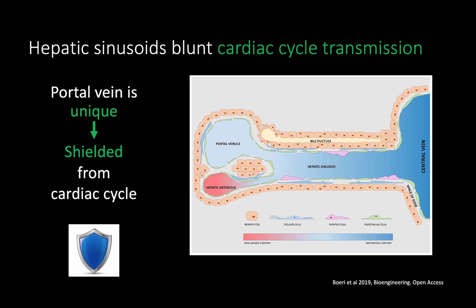The portal vein is unique in its isolation from the arterial and venous system, respectively by their splanchnic capillaries and the hepatic sinusoids. This explains the evolution from continuous monophasic to pulsatile flow in the patient with increased right-sided pressures. This differs from other biphasic or triphasic variability in other venous sites. In the healthy subject, there is a continuous flow with minimal variations during the cardiac cycle. Cardiac cycle pressures are transmitted to the portal vein with increasing right-sided pressures.